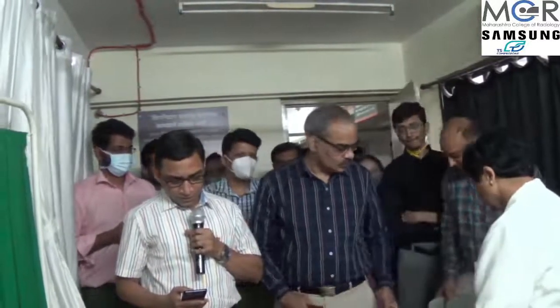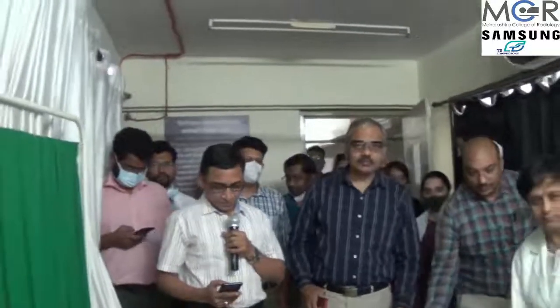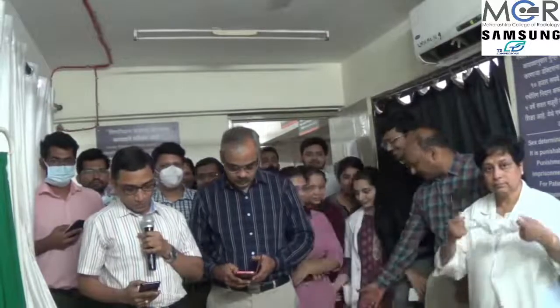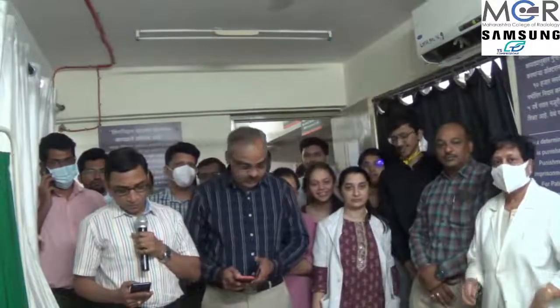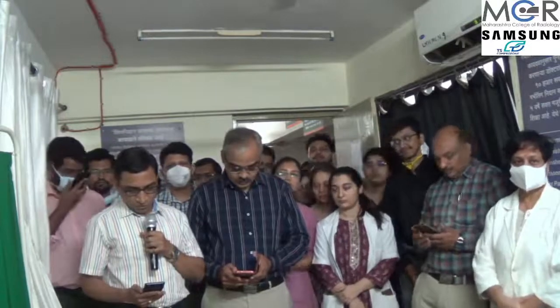Question 1 is, should we include the subendometrial hypoechoic halo in the endometrial thickness measurement? As I told you in the first talk, the subendometrial halo is not to be included while measuring the endometrial thickness. Only the endometrial echogenic lining, or the endometrial myometrial echogenic interface, has to be included in the endometrial thickness, and also the thickness of the anterior as well as the posterior wall combined has to be included as a total complete thickness. So one wall thickness is incomplete, so include the thickness of both walls, anterior as well as posterior. So I think that will address your query.